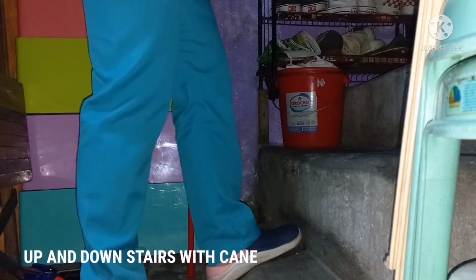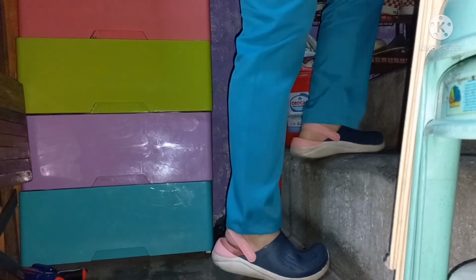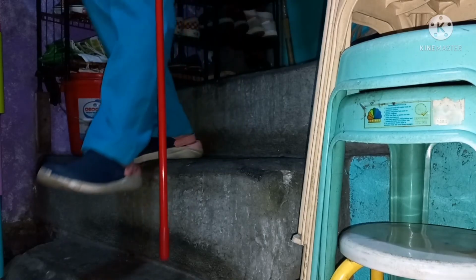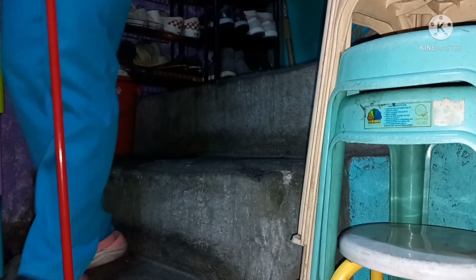Going up the stairs, the patient will move the good leg up onto the step first, and then will move the bad leg and the cane up onto the step. Going down the stairs, the patient will move the cane down onto the step and then move the bad leg down and then move the good leg down.